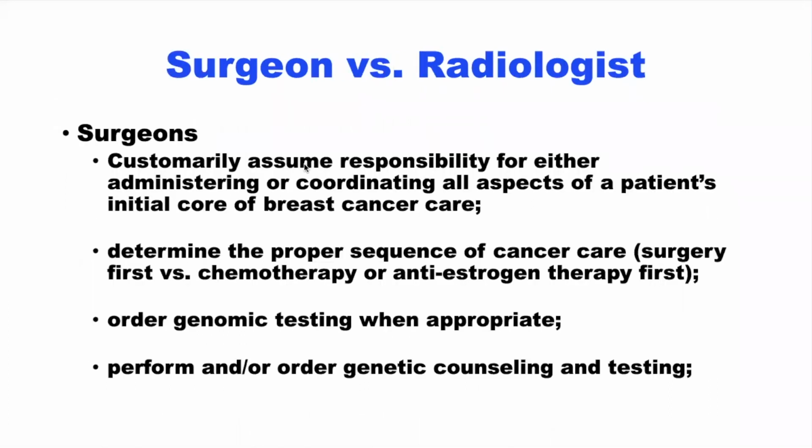Now, whether or not a patient experiences those can also depend upon the person that they're engaging with, the provider who actually performs a cryoablation procedure. As you know, many patients seek cryoablation amongst surgeons, some seek cryoablation amongst radiologists. And although both groups of individuals, when appropriately trained, have the skill set to perform the technical aspects of inserting the needle into the tumor and freezing it completely so that it's killed, there are differences, however, in how they manage a patient, not just a tumor.